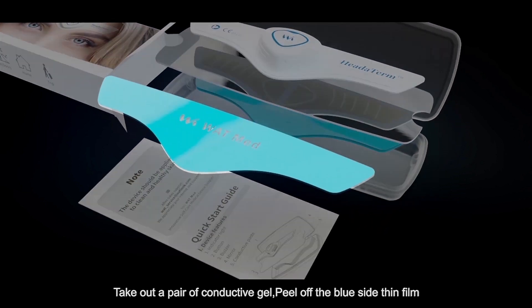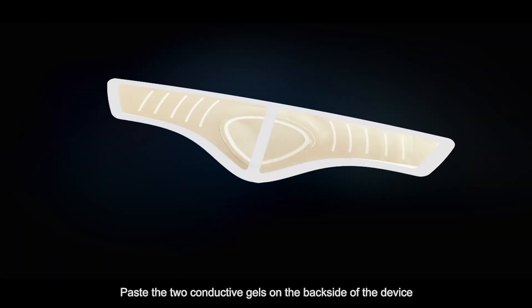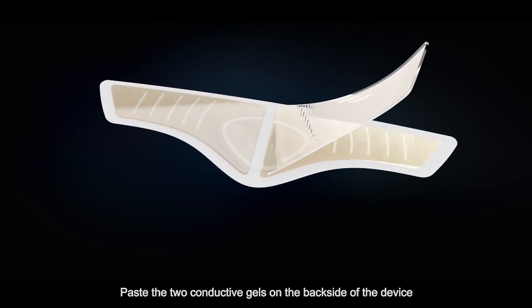Take out a pair of conductive gel. Peel off the blue side thin film. Paste the two conductive gels on the back side of the device.